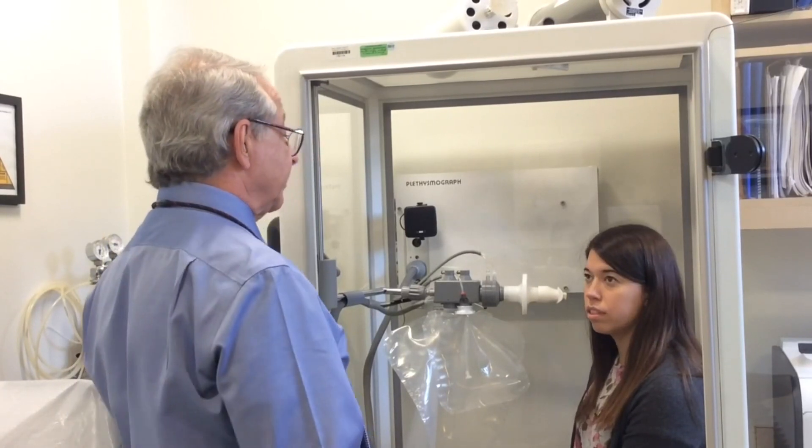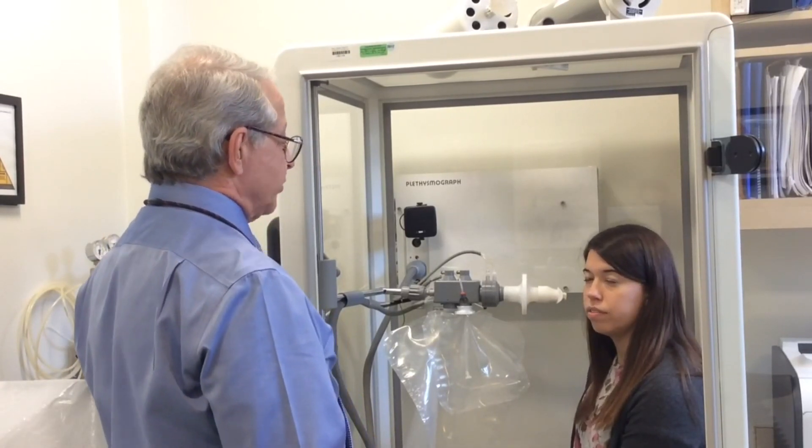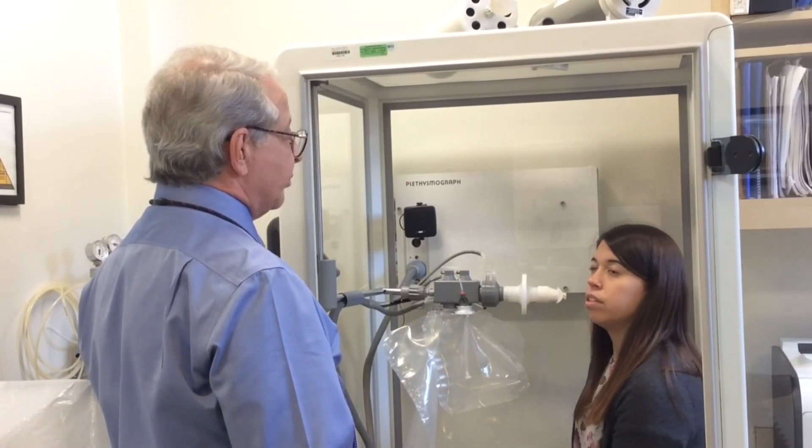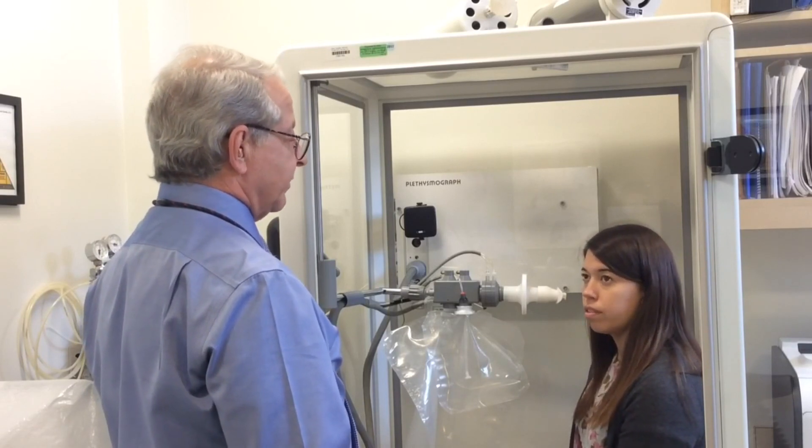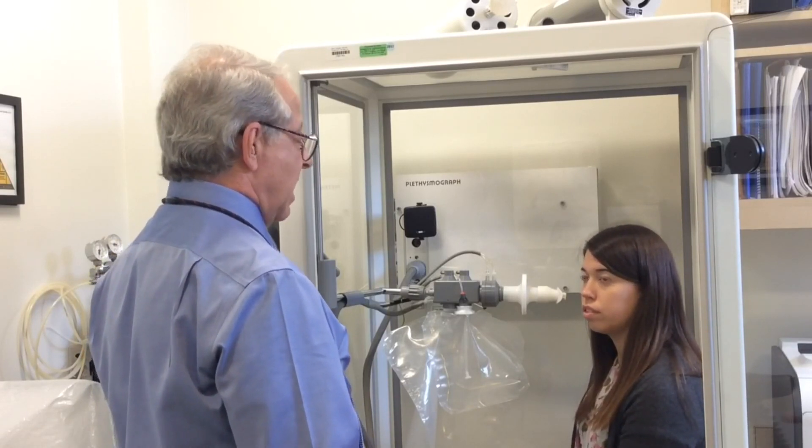The next test we're going to do is a diffusion capacity. So what you're going to do for me is breathe normally for a couple of breaths: in, out, in, out.